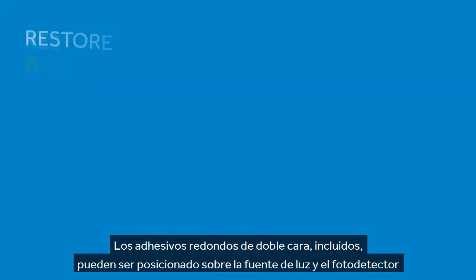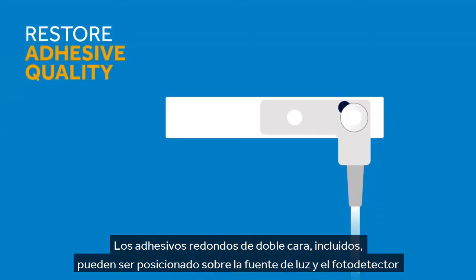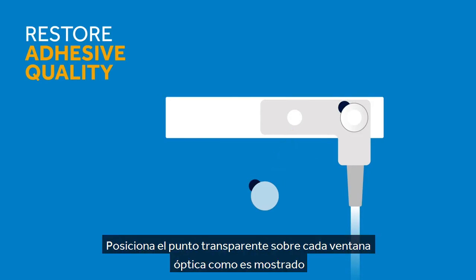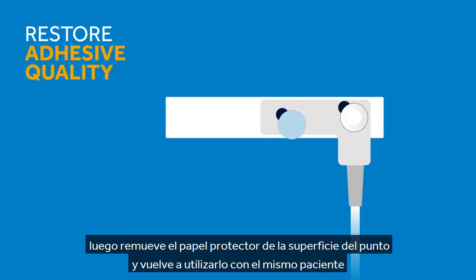The enclosed clear double-sided adhesive dots can be applied over the light source and photodetector to restore adhesive quality and extend the life of the sensor. Place a transparent dot over each window as shown. Then remove the protective paper that covers each dot and reapply to the same patient.